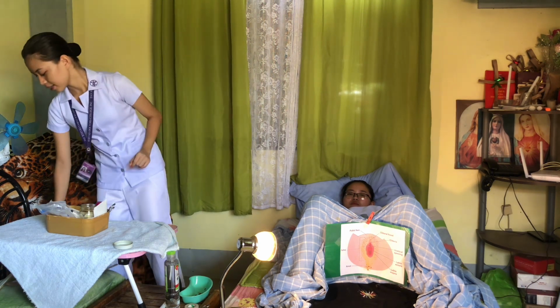Now we are going to open the set. So inside my set, I have an eye sheet, the sterile glove, the urinary catheter, and a cleansing solution. And I also have a pre-filled syringe, which is 10 cc, that we are going to use on inflating the balloon of the urinary catheter later on. And I also have the sterile forceps, which I have used on cleaning the private area of our client, and a lubricant. Now I am going to add a catheter on my tray set.